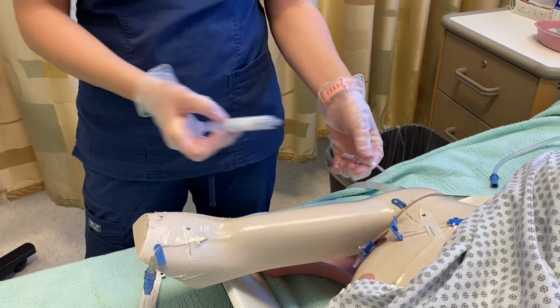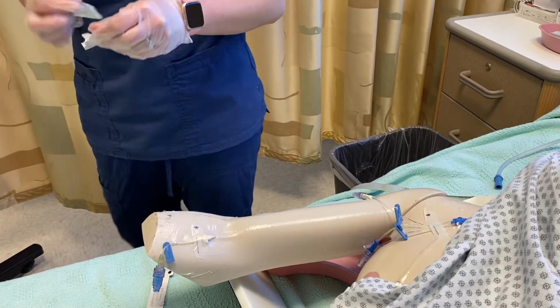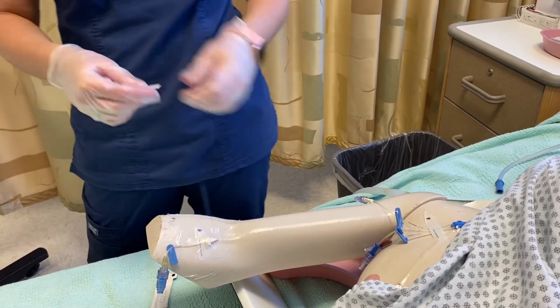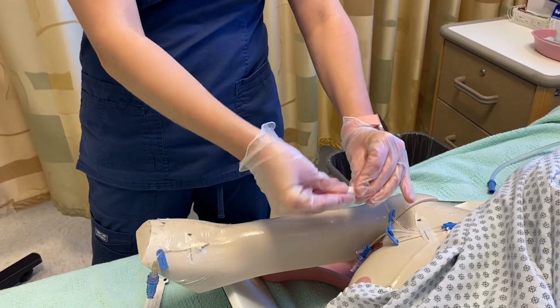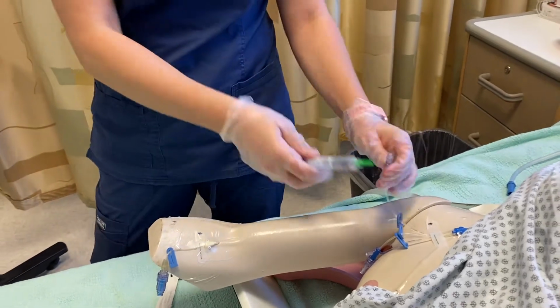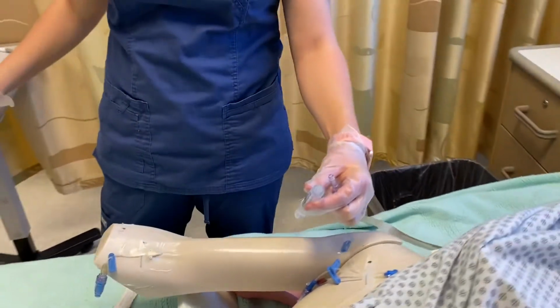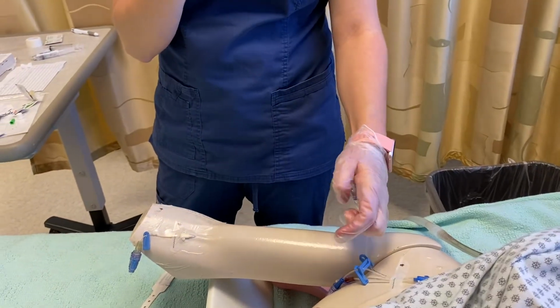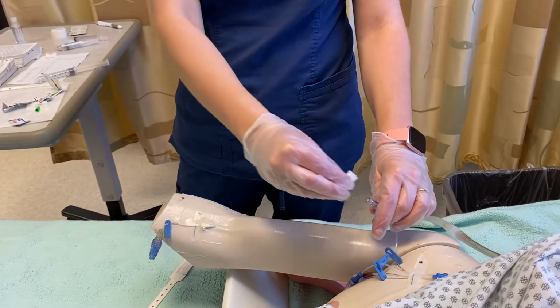Take that one off. Clean one more time. And do another flush because he was saline locked. Make sure there's no air. And I just touched the end of that, so I'm going to clean it again.